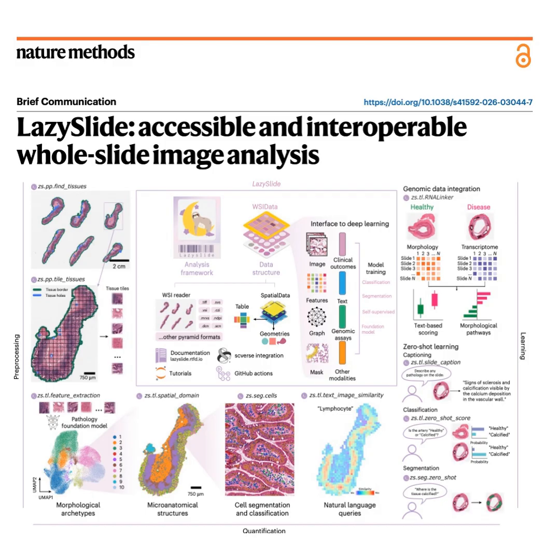Exactly. Let's do a quick recap of that because it's so important. LazySlide assigned accurate calcification scores using just a text prompt and top-K pooling. Then the RNA linker fused those visual scores with RNA sequencing data. And this multimodal approach uncovered the IL-18 signaling pathway's role in arterial disease. A massive win for multimodal integration.